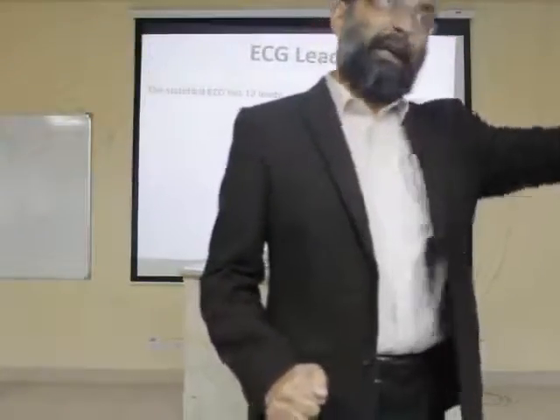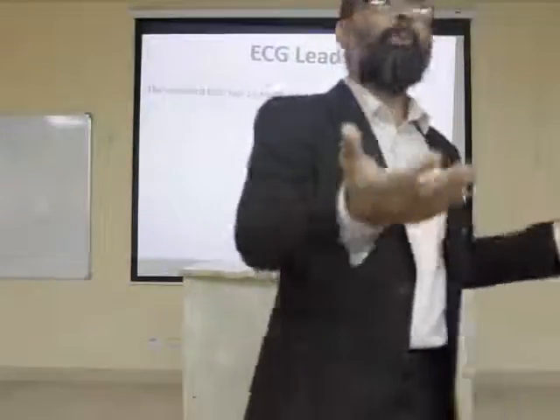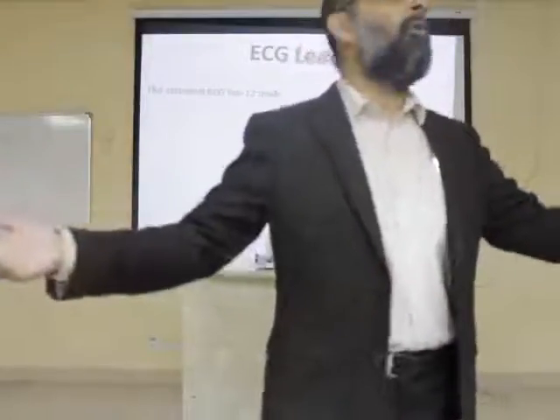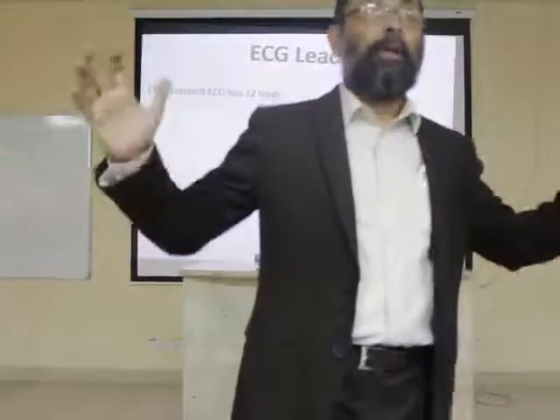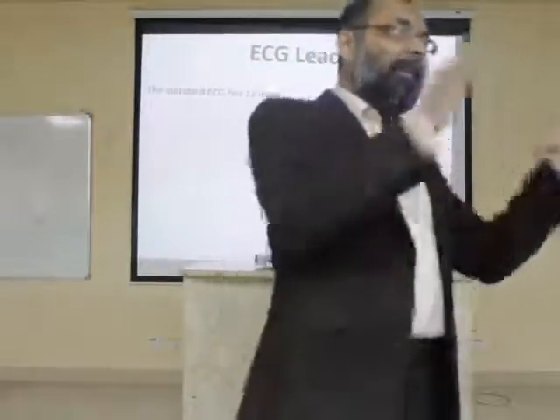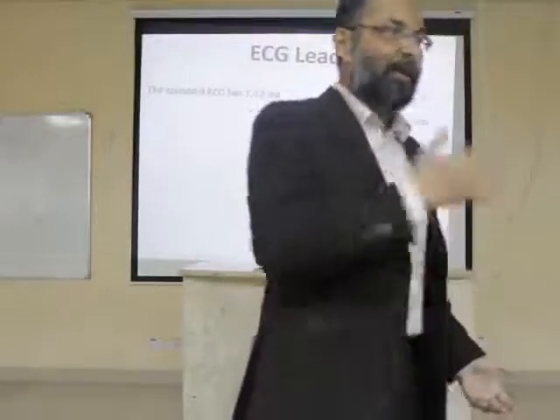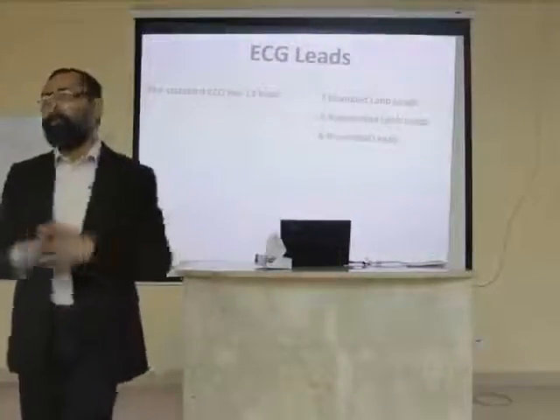Out of this, unipolar are 9 and bipolar are 3. Now you know why you are using unipolar system. For chest, unipolar is perfect. For limbs, if you increase the voltage, khalas, no problem, you can get the result. For bipolar, there is no additional maneuver required. You don't have to change anything. Bipolar is a bipolar system, perfect system. Okay? So now, do you get the idea? Unipolar system and the bipolar system, weaker system and stronger system, but the results are good. Why the results are good? We have explained. Why the chest results are good, why the limb results become better, and the bipolar system is a bipolar system.